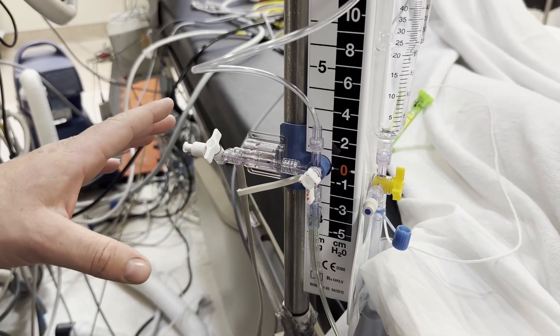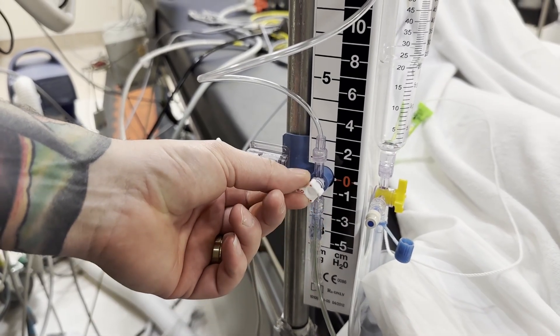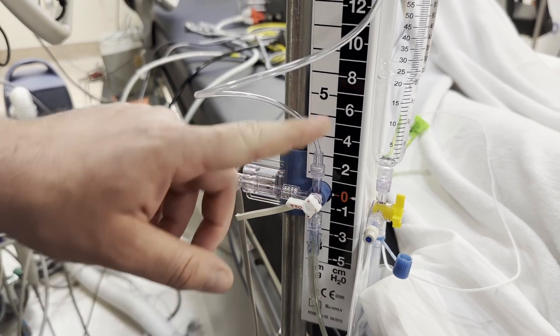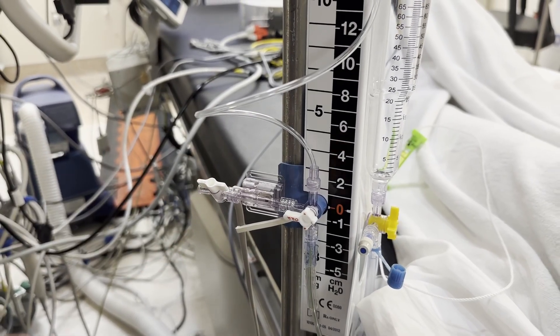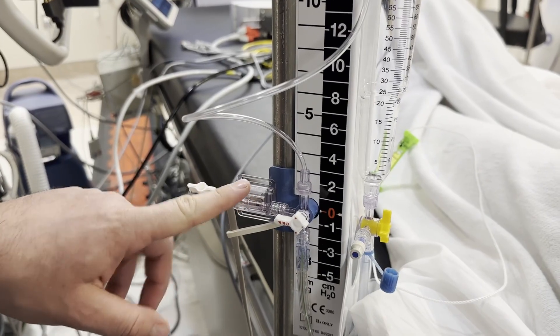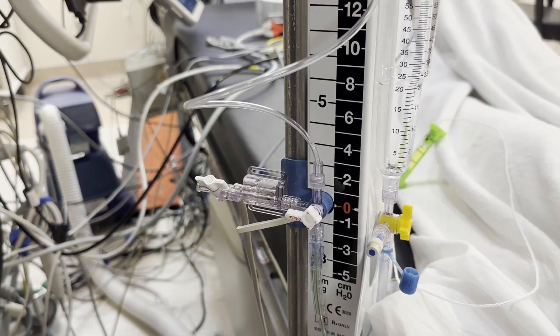Now we're going to zero. We're going to turn this stopcock off to the transducer — from the patient to the transducer and drain to the transducer. We're going to turn this open and take off this cap, so now we are open to atmospheric pressure. This is the transducer — this is what gives you the ICP reading. Then we're going to ask: can we zero the transducer?